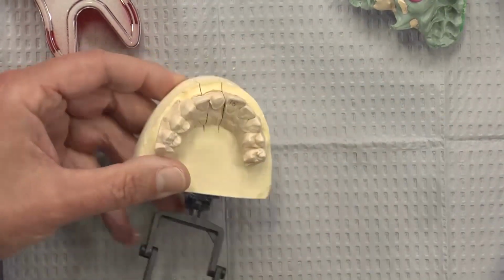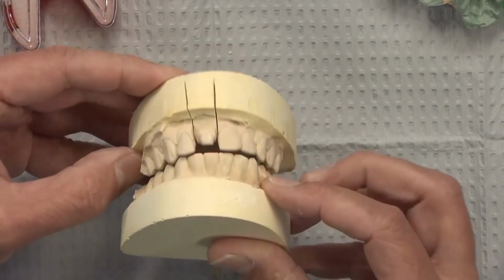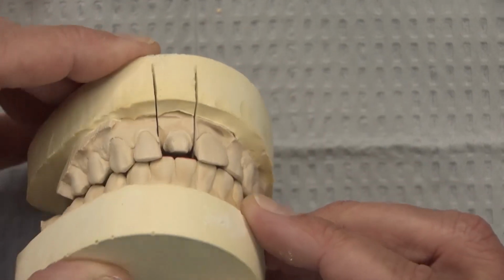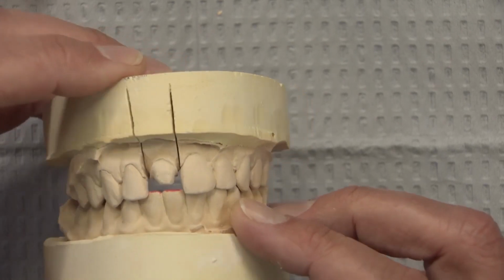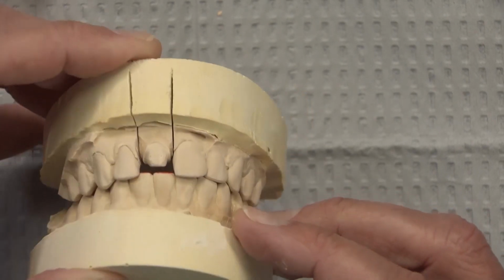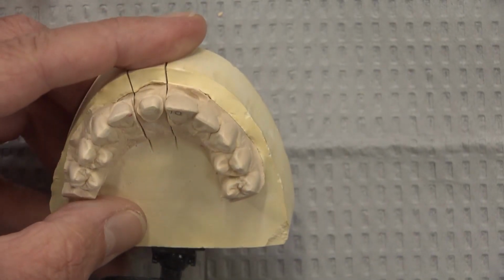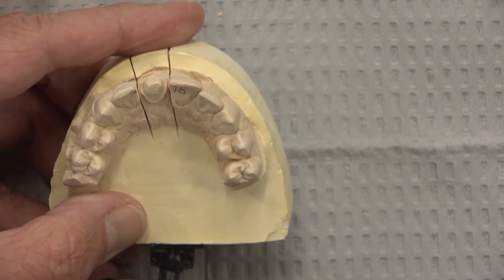Nice prep. Good looking prep. Good looking reduction. That's plenty of room for BruxZir. That's plenty of room for e.max. That's really plenty of room for anything.